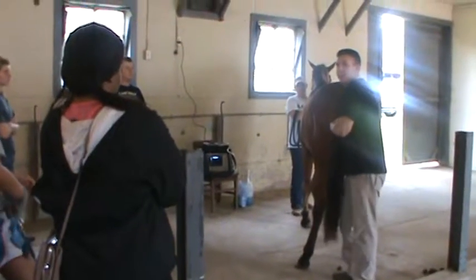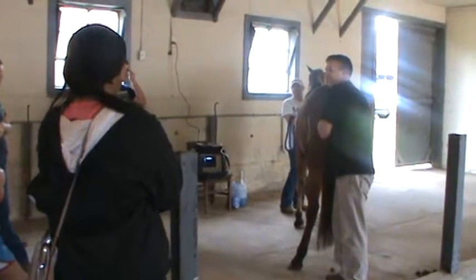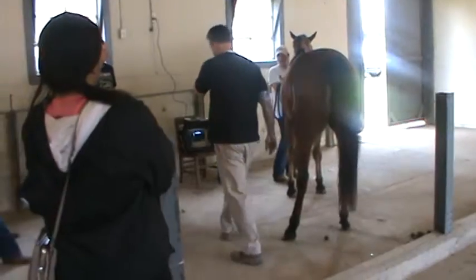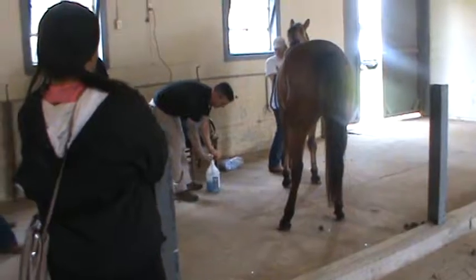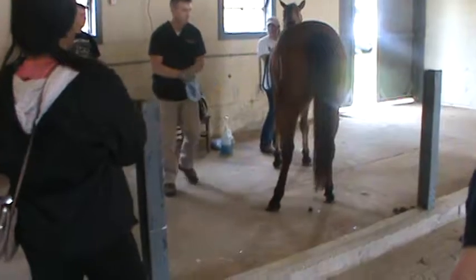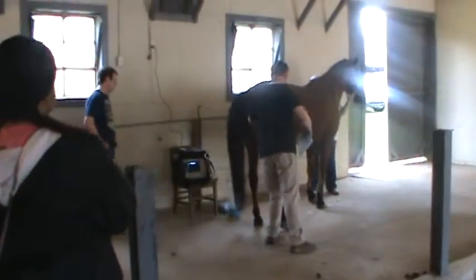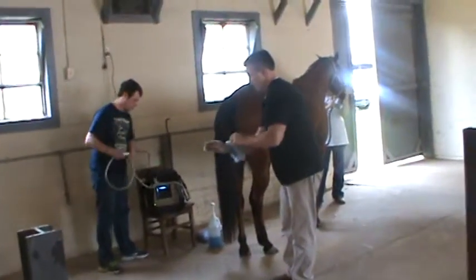Surprisingly, I've never been kicked doing this. All the injuries that I've had were at the front of the horse. Okay. All right. After I get the mare cleaned out, I always do extra lube just because I'm concerned about damaging the mare. I don't want to do any rectal tears. Try to get some pictures on the screen.